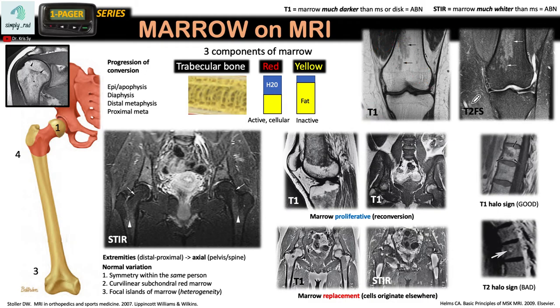On the T2-weighted fat-saturation sequence, the yellow marrow now has a darker signal because fat is suppressed. The red marrow becomes bright in signal again because of its higher water content. When comparing red marrow to adjacent muscle, it should be intermediate or iso-intense to be considered normal.